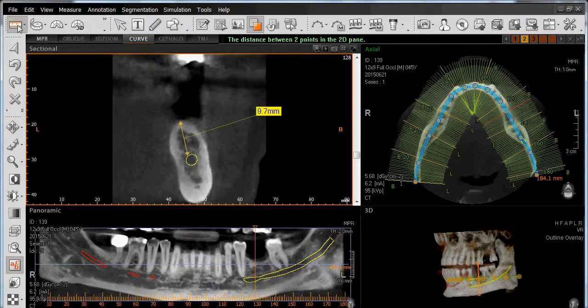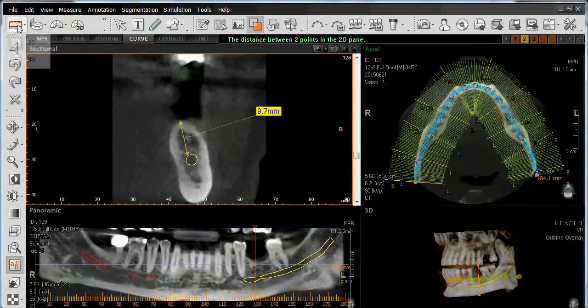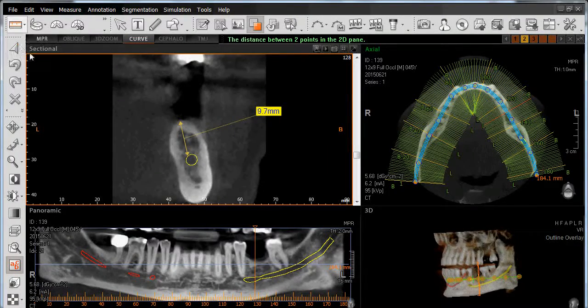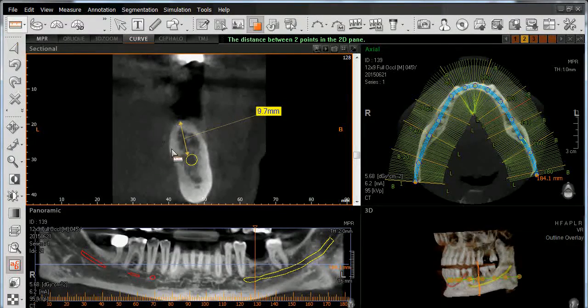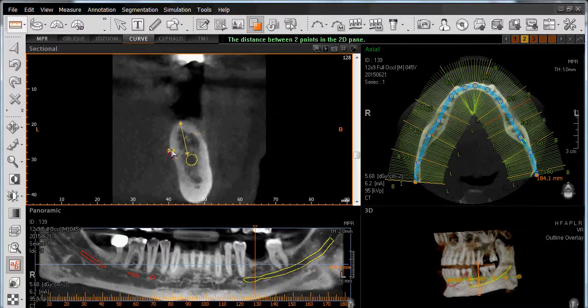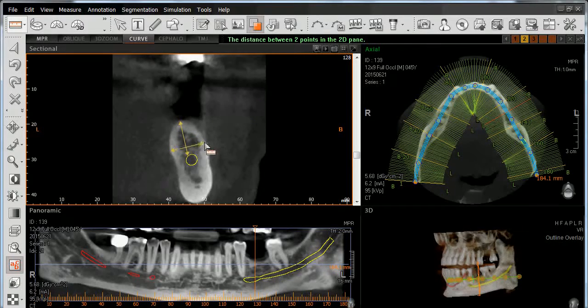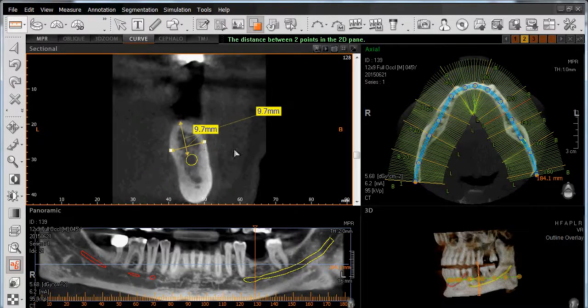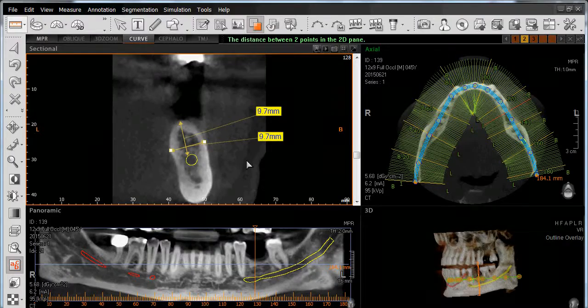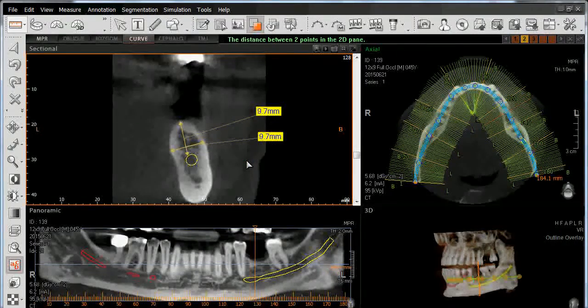We can also utilize the same tool again to measure our bone width, going from the lingual plate to the cortical side of the buccal wall, where we also have a dimension of 9.7 millimeters.